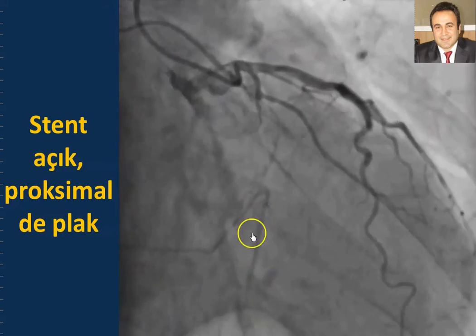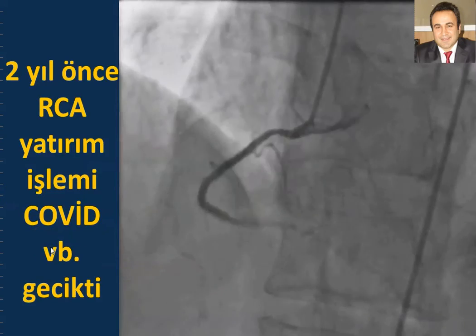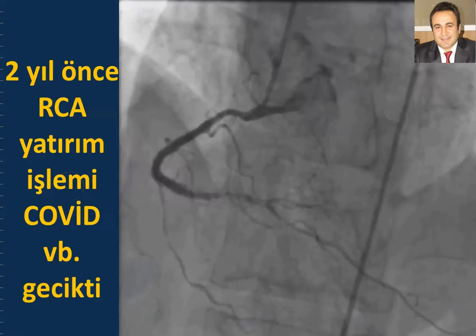The circumflex territory was not viable, and this is the investment PCI.